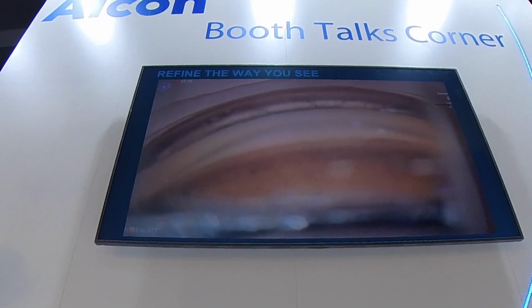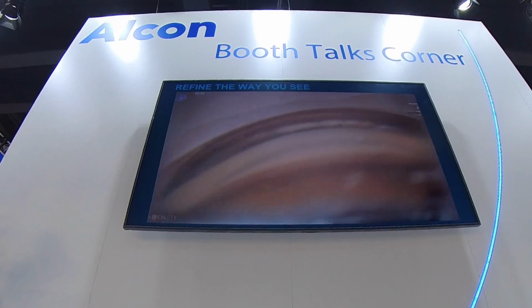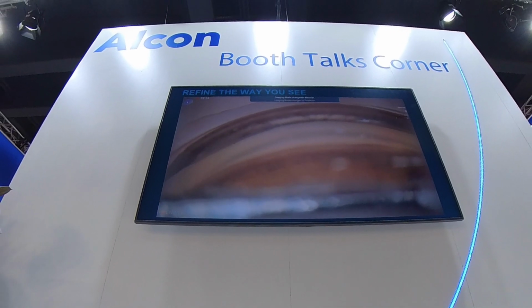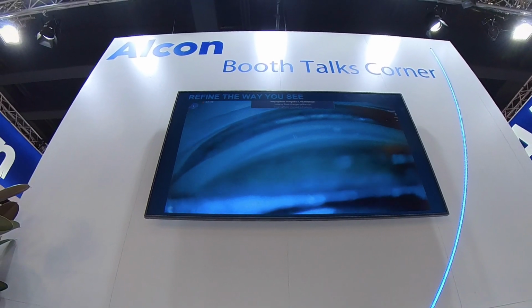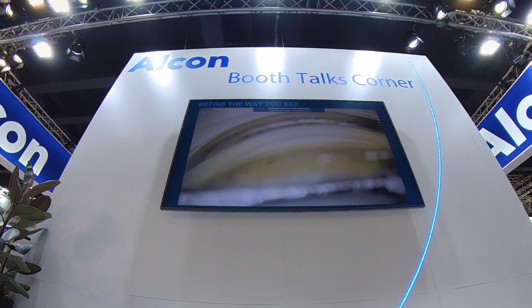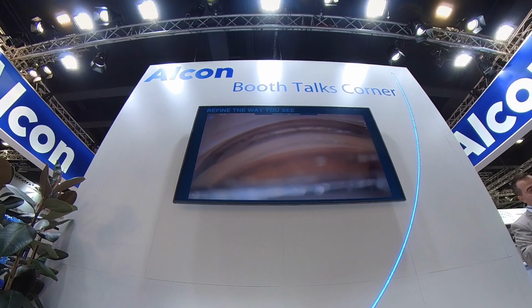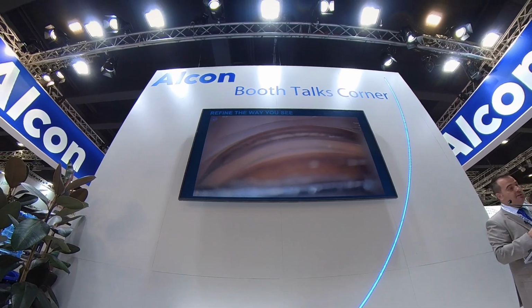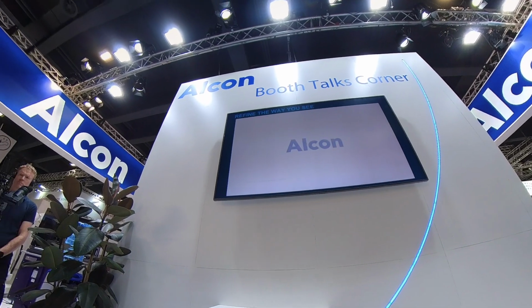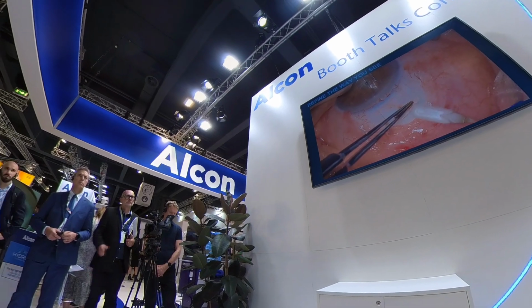This is an example of gonioscopy with a Mori gonio lens, and you can appreciate the structures of the angle. You can also apply digital filtering in order to enhance certain structures of interest. So this is the next door which will be opened in digital visualization, the digital filtering. The next thing to show is a classical Express device implantation.